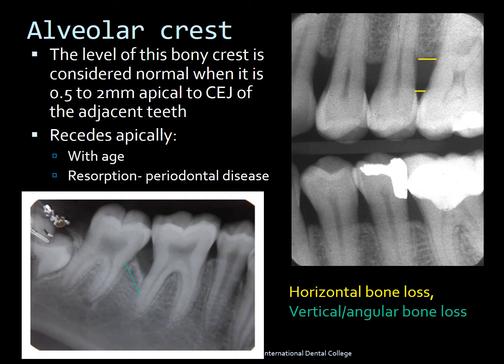Moving on to the alveolar crest — the height of the bone or crestal bone is what is called the alveolar crest. It is considered normal when it is about 0.5 to 2 mm apical to the CEJ of the adjacent teeth. Looking at this radiograph, the yellow mark indicates the CEJ, which is the cemento-enamel junction. This is a perfect example of bone loss — horizontal bone loss — where the actual bone level is seen to be much more apical than normal. Anywhere between 0.5 to 2 mm from the CEJ is still considered normal; anything beyond that is considered bone loss.